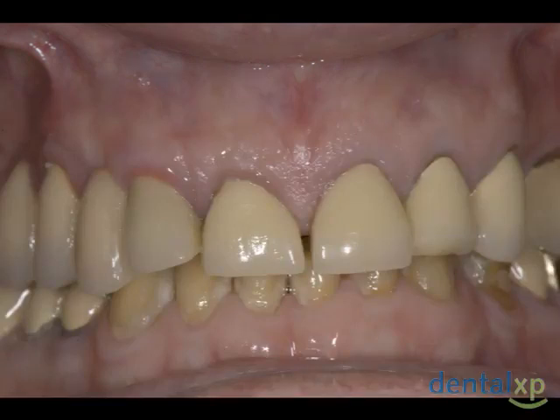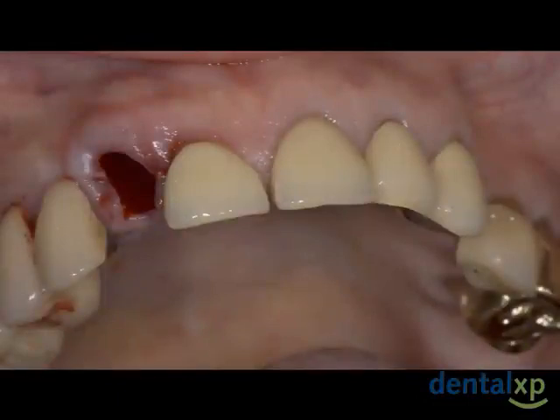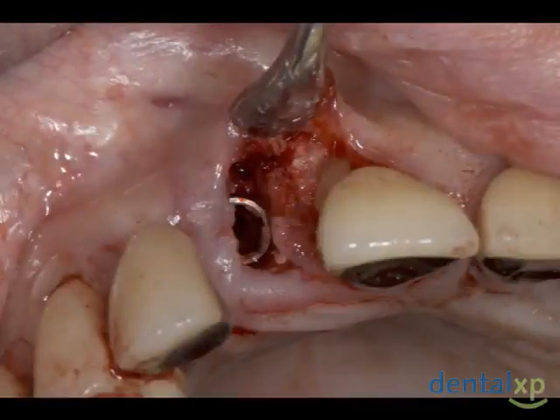The third case will show a contoured healing abutment developing the proper emergence profile. The contoured healing abutment has been pre-shaped to the dimension and the emergence profile of the particular tooth that has been involved. In this case, the upper right lateral incisor has been broken off at the gum line. The tooth was extracted and the implant was placed in the extraction site.